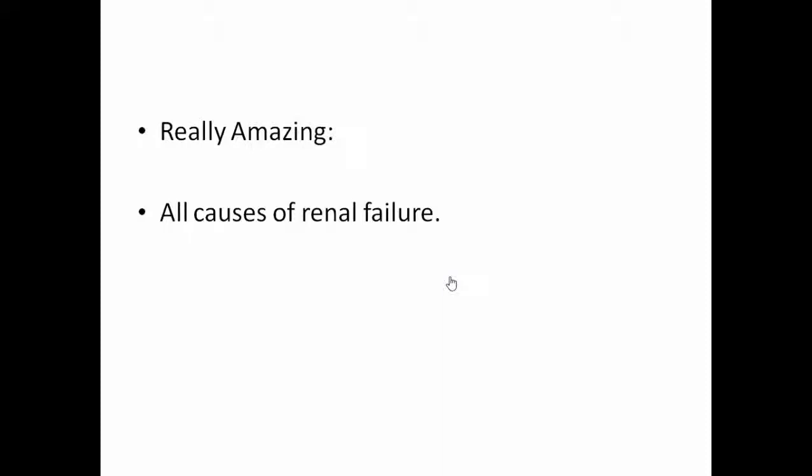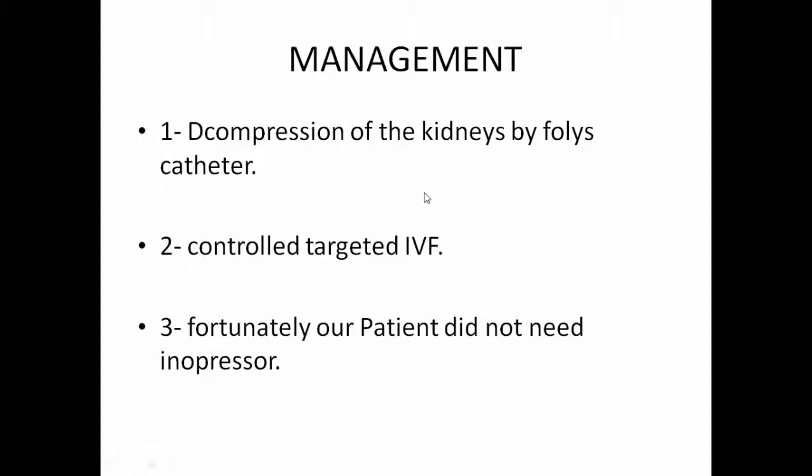I always say, and you will always hear from me, a lot in one shot. This is the value of ultrasound in critically ill patients. You can get a lot of information in one shot of the ultrasound probe. This is the case in every case I will present here. You can get a lot in one shot, okay? And this is the value of ultrasound in diagnosing acute renal failure. Let us see what we can do for our patient.